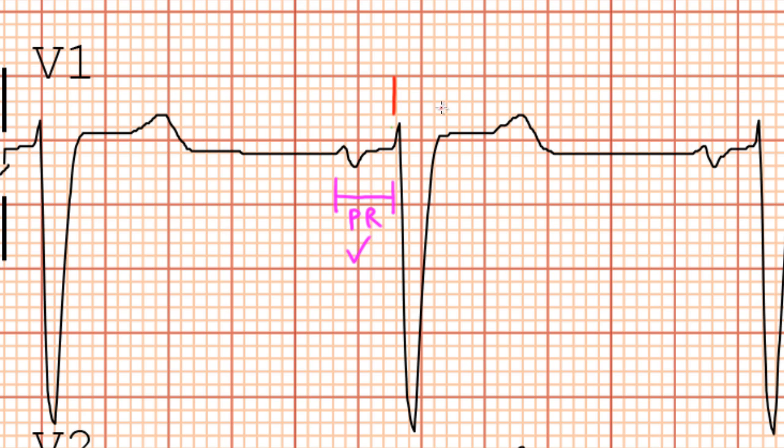You'll notice, however, that the QRS duration is wide. It's wider than three small boxes. So, in this case, this is a bundle branch block. This EKG is an example of a patient with a left bundle branch block. However, we'll talk in more detail about bundle branch blocks later. But this is just to give you an idea of what it looks like.